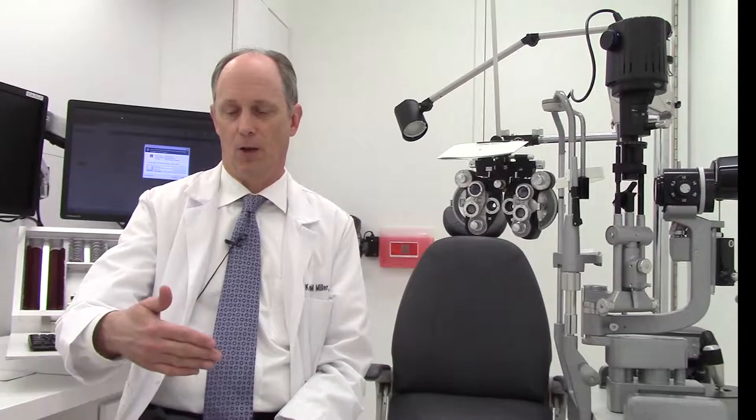This is a single footplate device, and I'll orient the footplate towards me, and I'll run it on the patient's conjunctival tissue. Then the diamond is on the cornea side, and it will be just inside clear cornea.